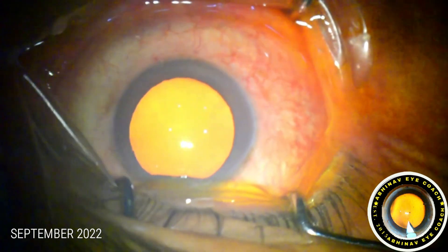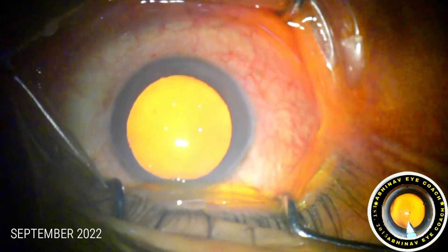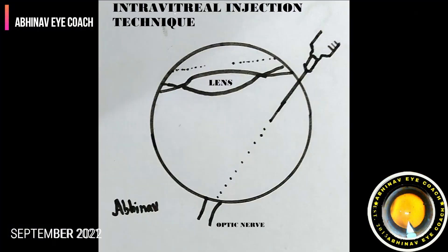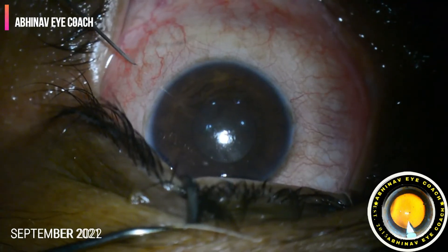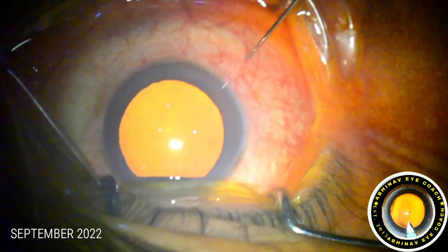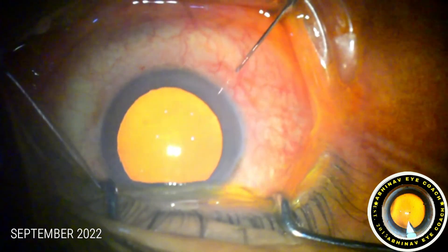The direction of the needle while giving the injection should be pointed towards the optic disc, and care must be taken not to touch or perforate the posterior capsule of the crystalline lens. The injection is directed towards the disc.